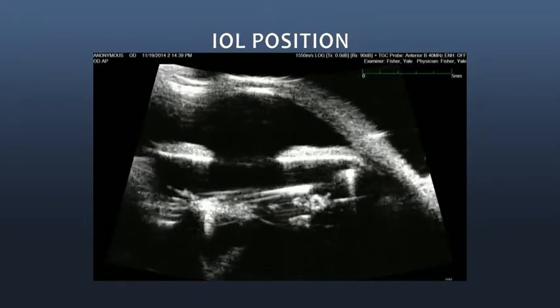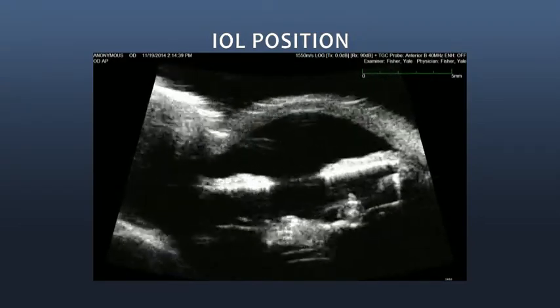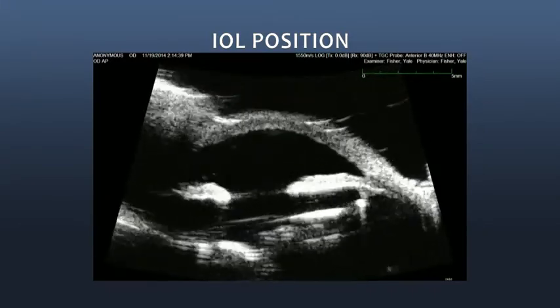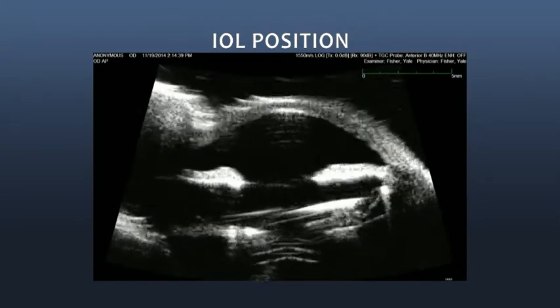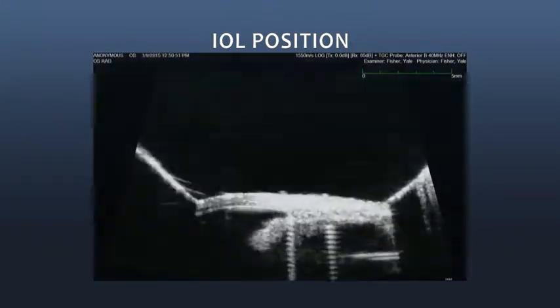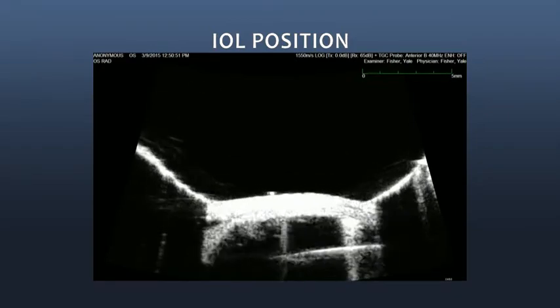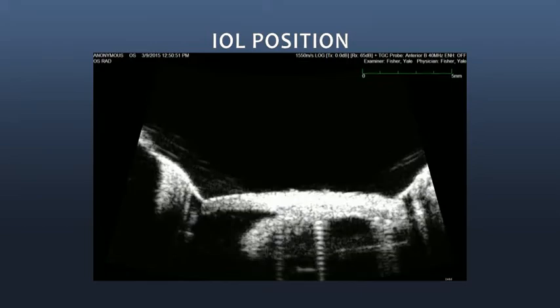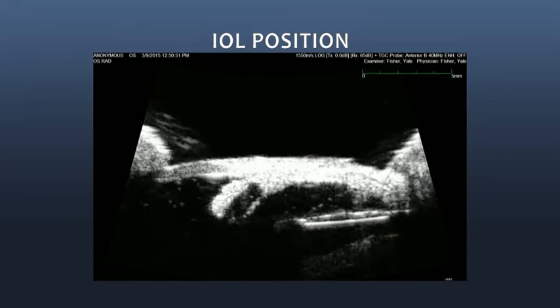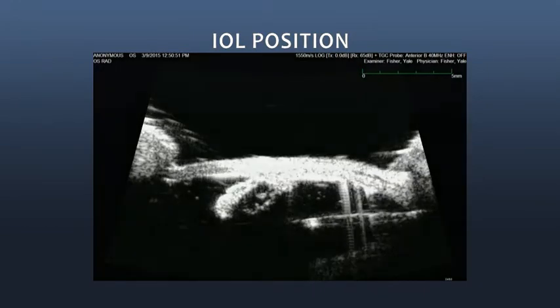As the lens goes further and further posterior, it is possible to see the distance between the iris and the implant and the residual lens material within the capsular sac. And in this situation, the IOL has slipped well below to the 6 o'clock position over the pars plana. You can also see some artifacts produced by perfluorocarbon liquid that has accumulated from previous surgery in the pars plana region. Those peculiar comet-like effects are typical of foreign body ringing. In this case, it is residual perfluorocarbon small bubbles.